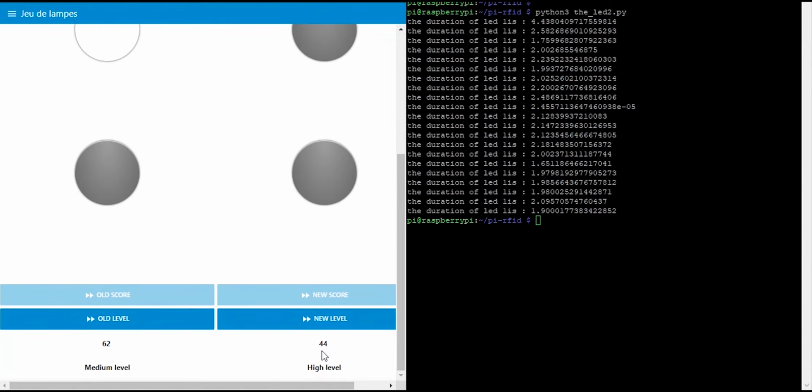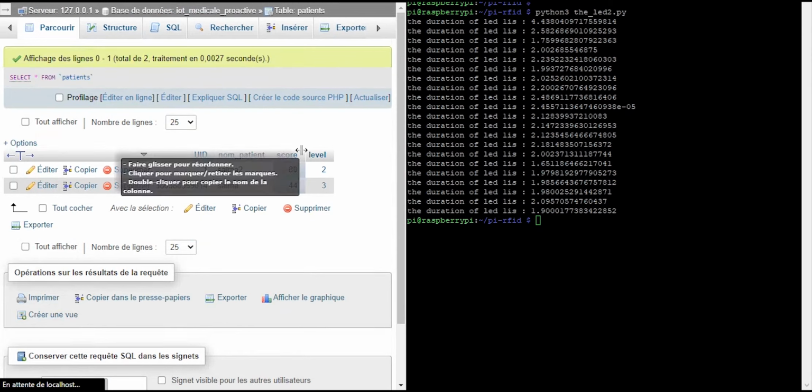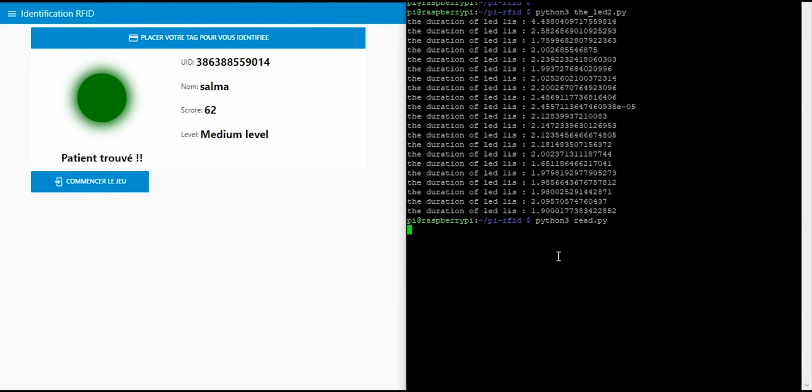After completing the test, we can see that the new values have changed. And also, if we check and refresh the database, we will find that the new data is there, so that the next time the user enters again, he will be remembered with his last score and level.